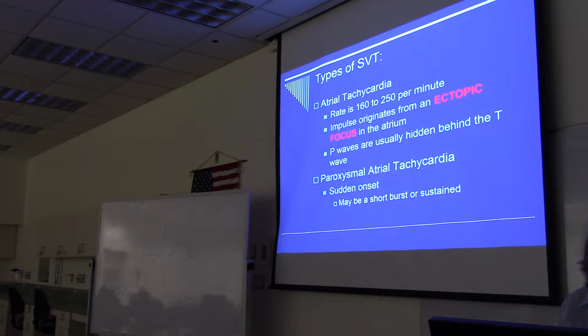Okay, so knowing that and SVT, is there really anything different between them? It's all the same, isn't it? Yeah. So to me, you could use these two words interchangeably. An atrial tachycardia and an SVT is the same thing.